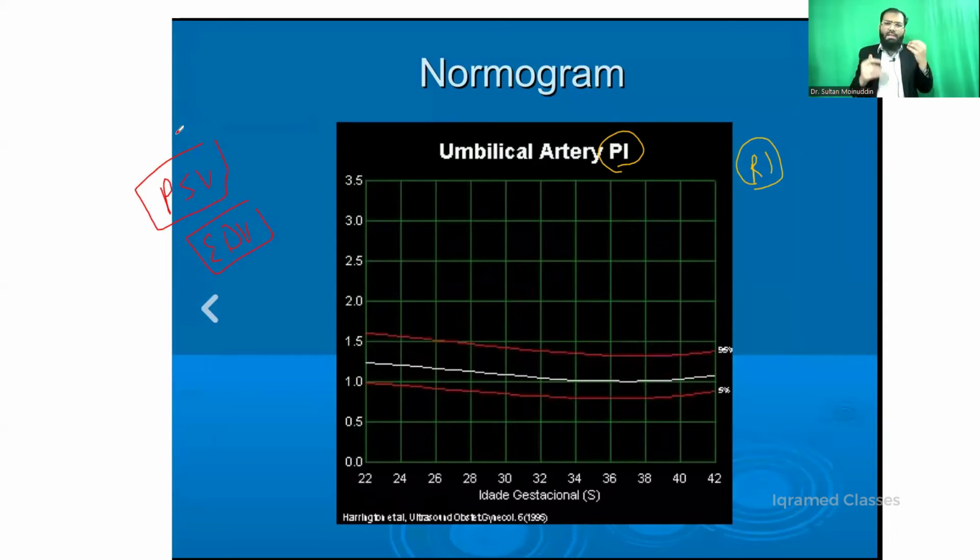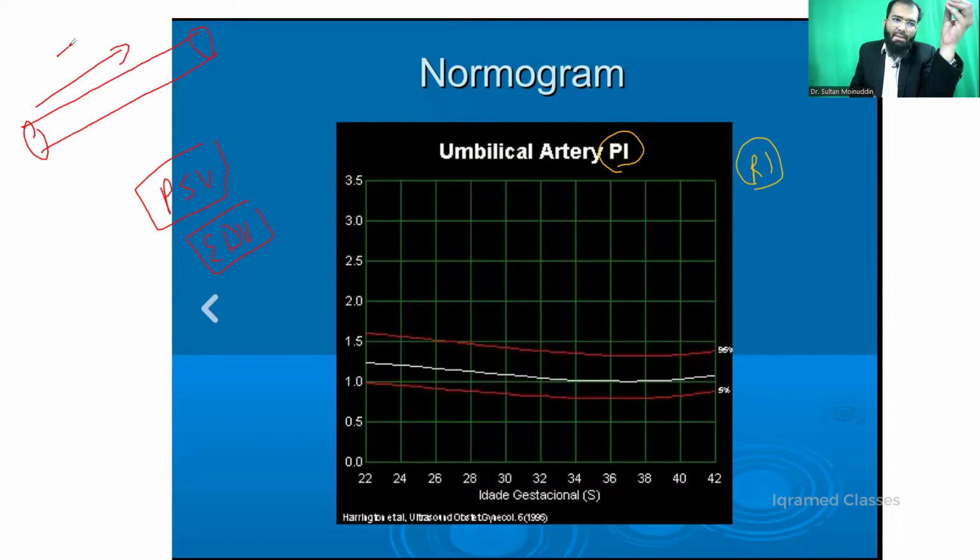Just like when we read physics in our basic school days. What did you have? That there is a conductor, and through this conductor there is current which is passing, and when the current is passing, it is electrons which are flowing inside in the opposite direction. When these electrons flow, there is a resistance to this, and the more the resistance, the lesser would be the current. Same here. So more the resistance, lesser would be the blood flow.